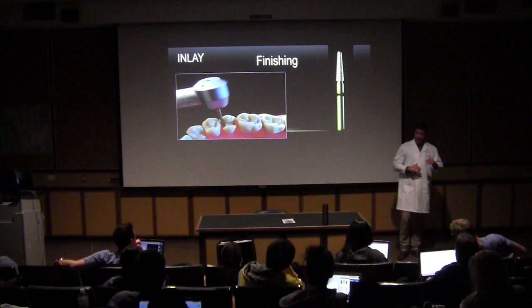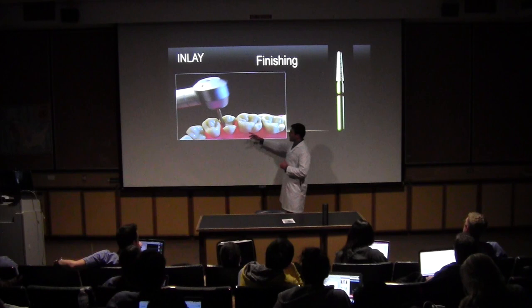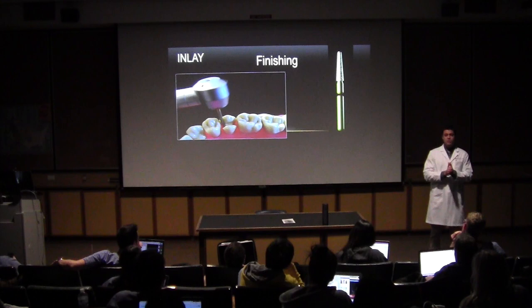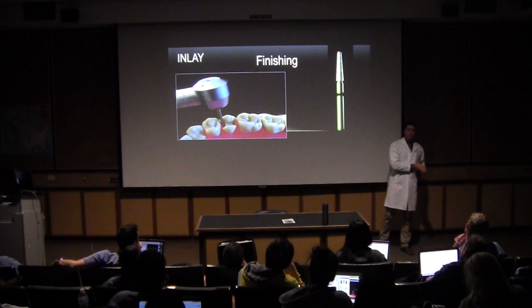So after that, we are going to smooth all the walls. The surrounding walls, the pulpal, the axial, the gingival, all the walls. And we do that with a fine or extra fine diamond point, the same size, the same diamond point that you used to do the prep. You can have one with fine or extra fine and work with this diamond point before you finish to smooth all the walls.